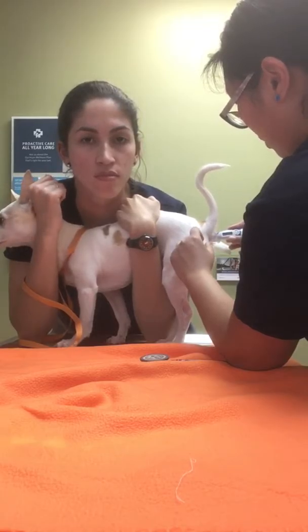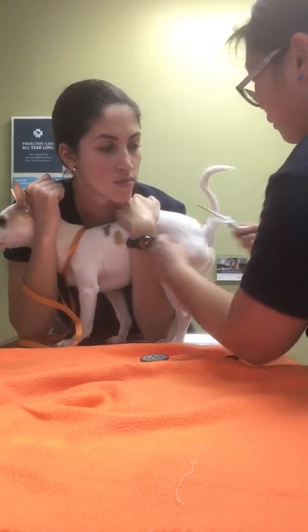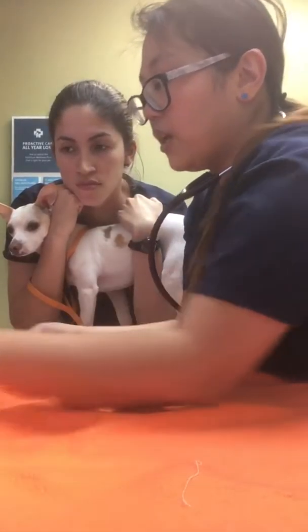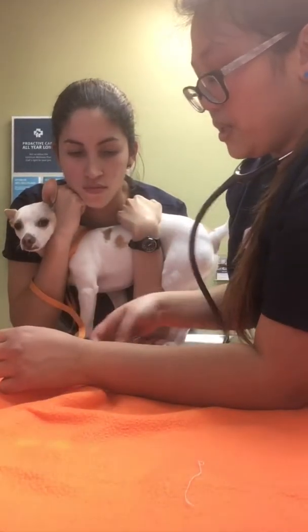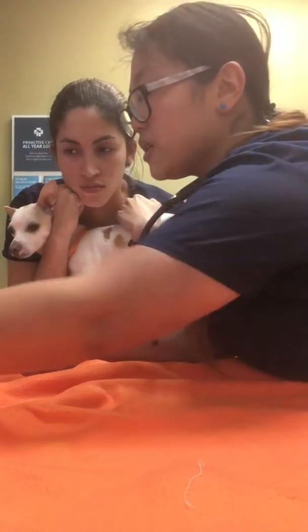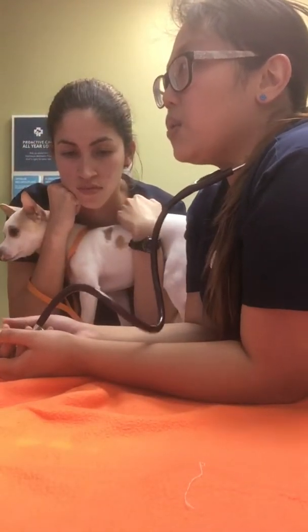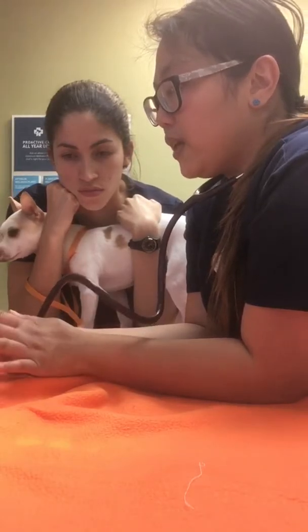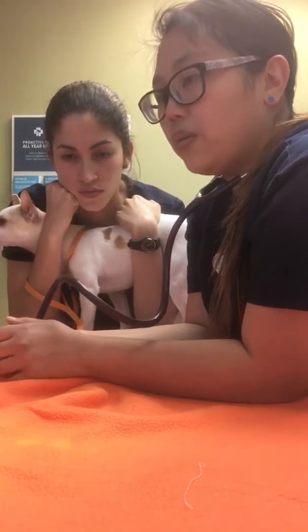Right now he is at 102.4. It is a little bit elevated because Gizmo is feeling nervous. Usually if the temperature is elevated because of excitement or nervousness, the temperature would be repeated after 10 minutes, along with alcohol on the feet and on the back and chest to try to cool down the patient.